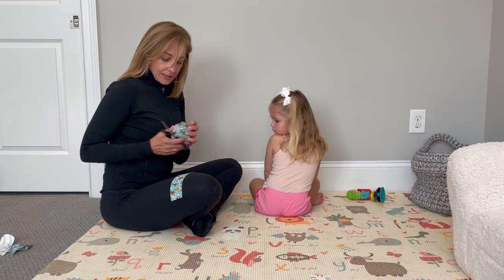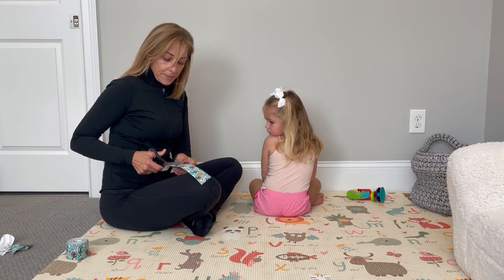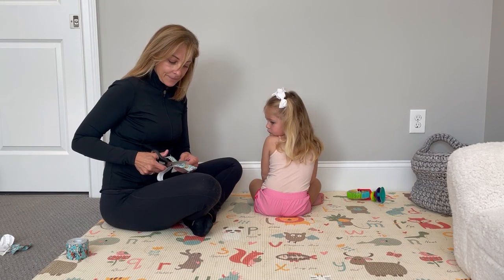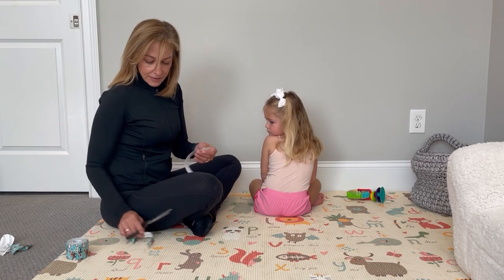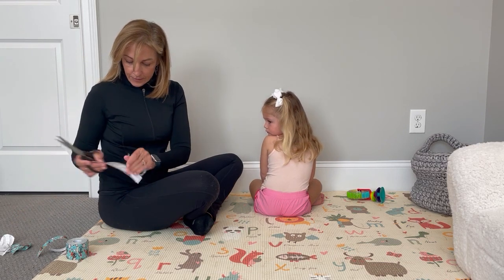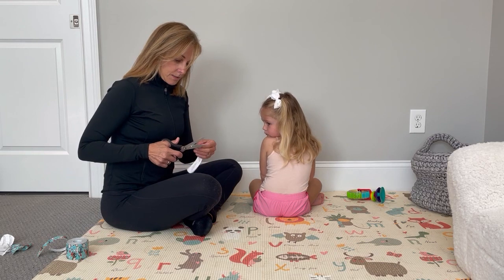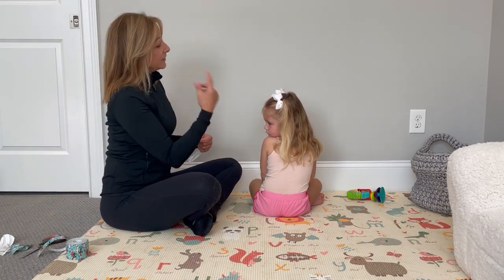I'm going to cut it. I'm also going to cut the tape a little bit more narrow because she's small and she doesn't need this big wide piece of tape. And remember, you're going to cut off the ends, so make sure you round the ends. Then I'm going to cut off the other end. Like that. And Camden's going to look at the wall.